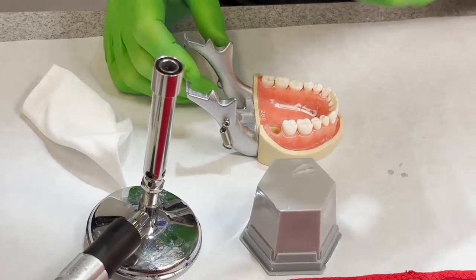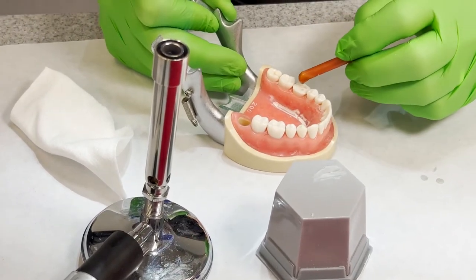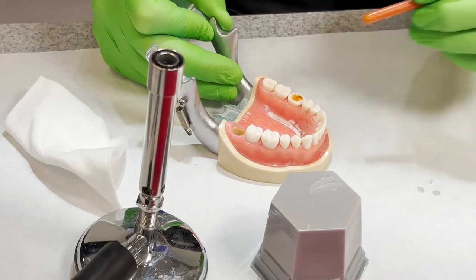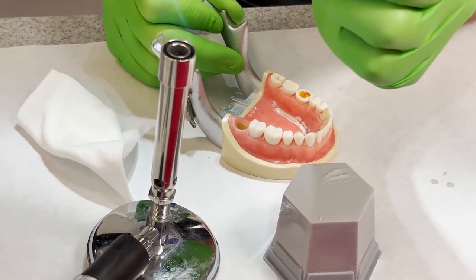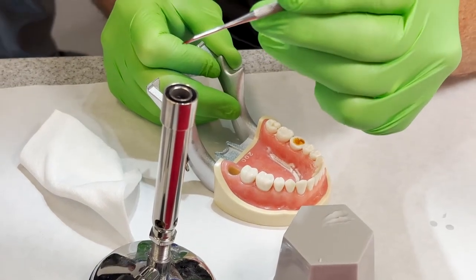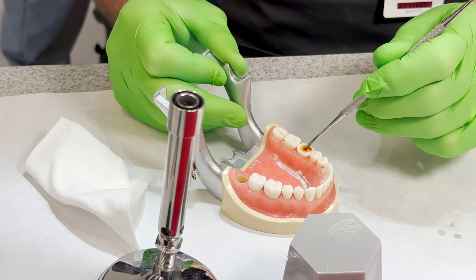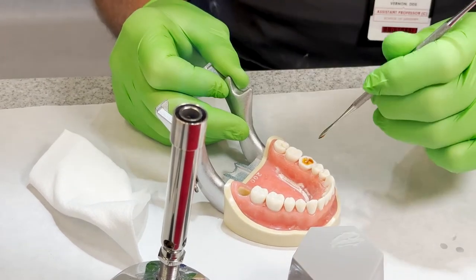So I'm gonna go ahead and put my sticky wax on. It needs a drop, maybe. And it's no biggie where you put that, okay? If you don't like it, you can heat this up and maneuver it where you want if you got too much on, okay? But you will want a little bit on there. I'm going to avoid the margins too, because again, I don't want it around there when I'm carving back the tooth.